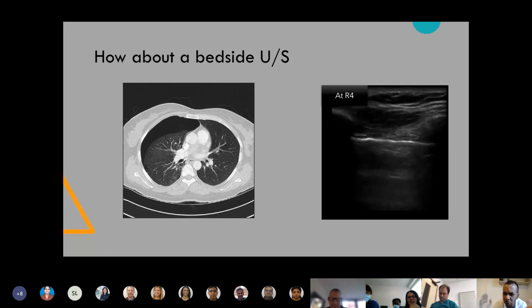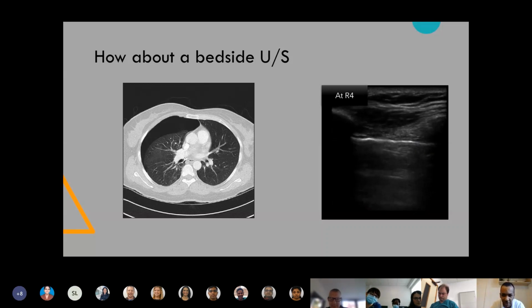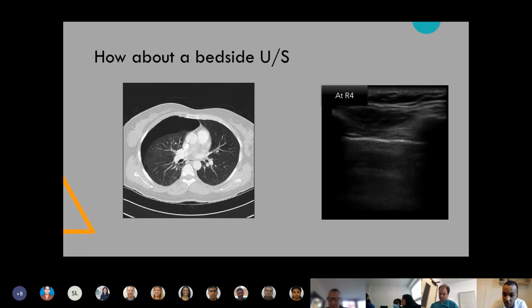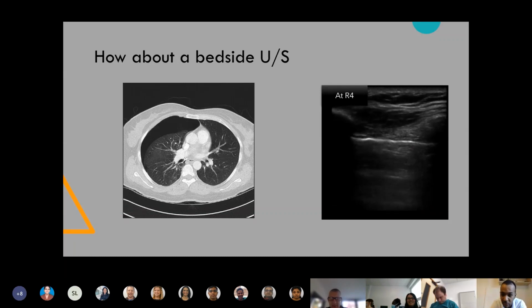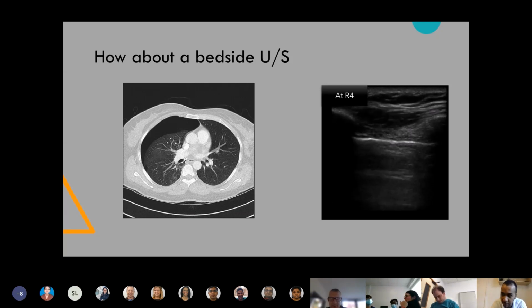We used to have a small portable ultrasound at that time. We did not have the big SonoSites or the General Electric ones. We had a small ultrasound which you handhold and just do the scan. And I obviously used the linear probe because it's high frequency. It gives you very clear images of the pleura when that's what you're concerned about. If you're concerned about pulmonary edema and hemothorax and all of that, then you need to use a curvilinear or phased array probe. But because I was focused on the pneumothorax diagnosis and pleural sliding, that's why I used it, and it gave me very clear images of a lung point, which was confirmed by a CT scan.